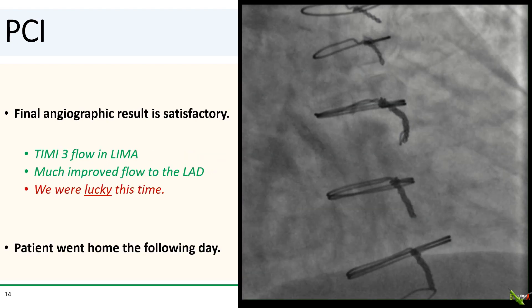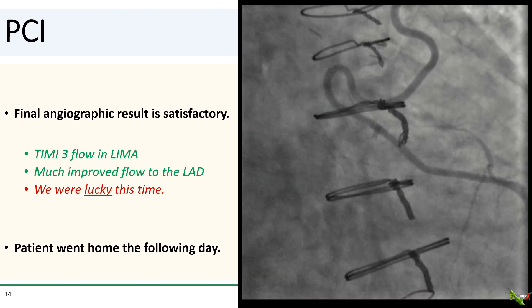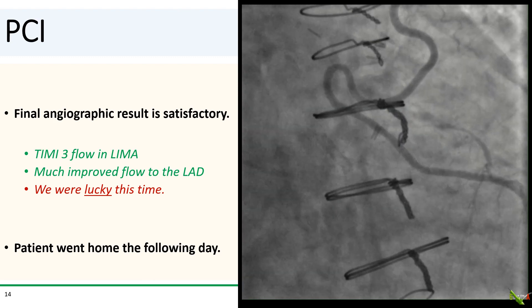After more post-dilation, here's the final angiographic result, which looked quite satisfactory. There was TIMI-3 flow in the LIMA. The flow in the LAD is also much improved — and you really lucked out this time. The patient did fine and went home the following day.